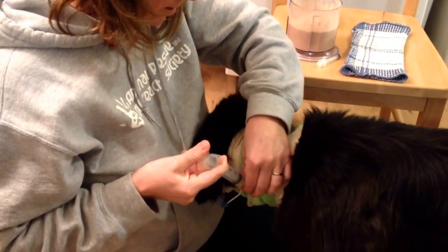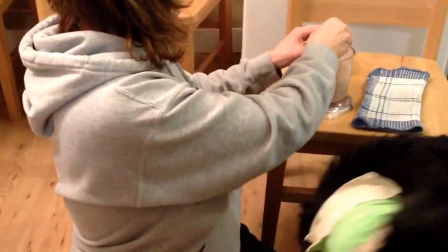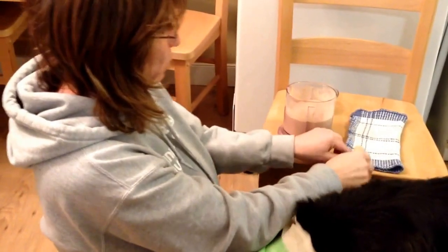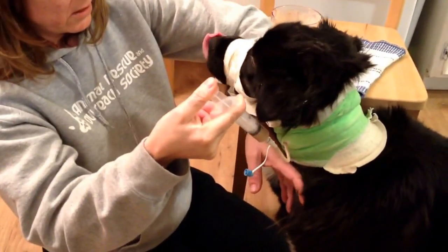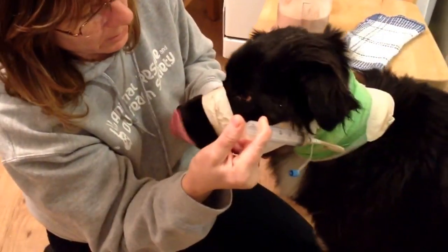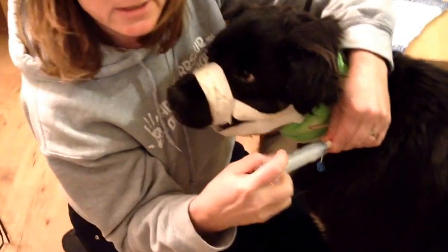Two minutes. And now the food — this is two cans of the recovery formula mixed with water, and then put through the blender. So this can be a bit of a slow process; you can imagine two cans going into her. The food just goes right into the tube — just like that, and very gently. We do a few cc's and then wait for her to swallow. Good swallow! You can see she's quite a bit brighter today, so everything's good. And that's it — now we repeat.